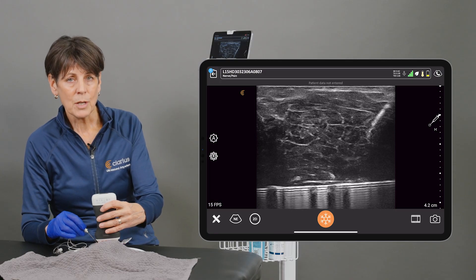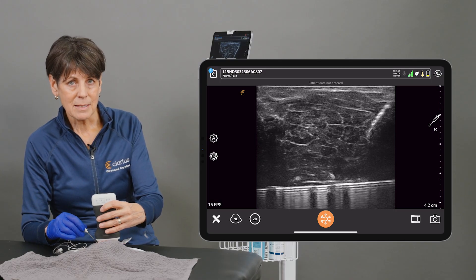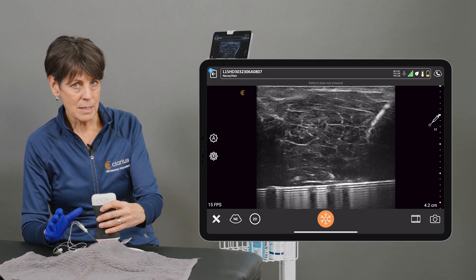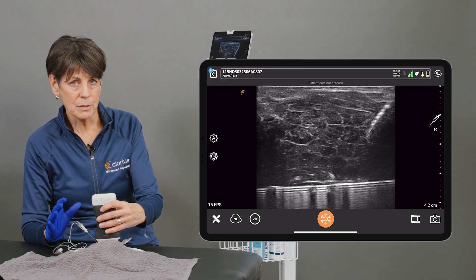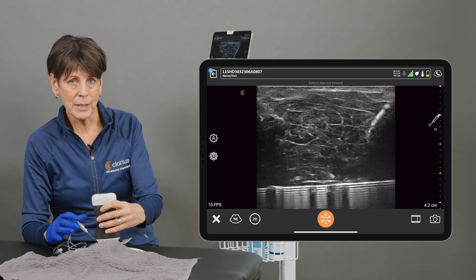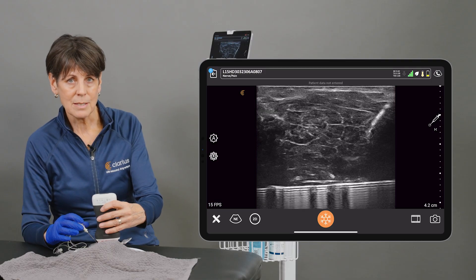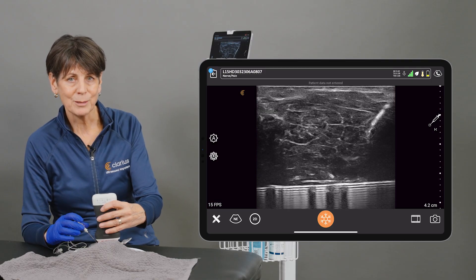So try the Needle Enhance. It really lights up your needle when you're doing in-plane injections at a steeper angle.